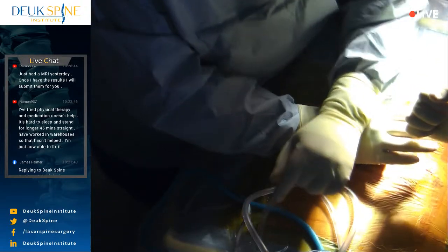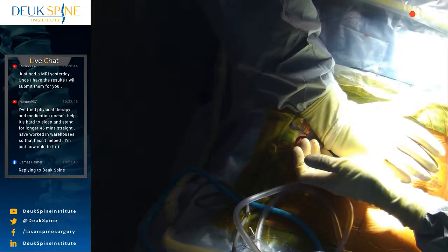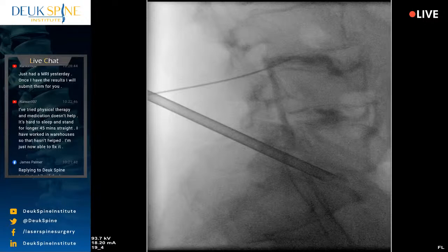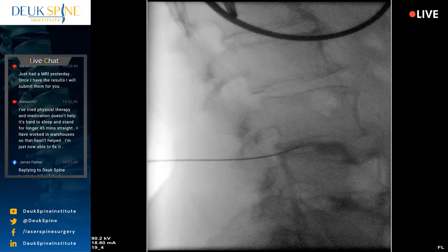gram-positive bacteria. Now, the most common cause of infections from spine surgery are gram-positive bacteria. It was wonderful using bacitracin because it was cheap. You could put it in the irrigation. It was water soluble, like a lot of antibiotics are not. And it was very effective at preventing infections. But now it's impossible to get it because of the reported complications from intramuscular injection, which we don't do, once again.